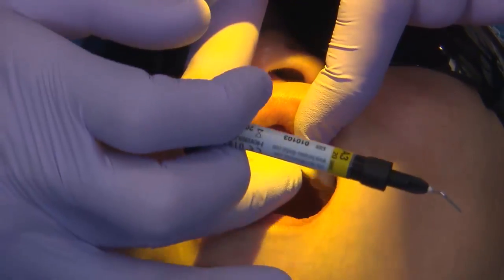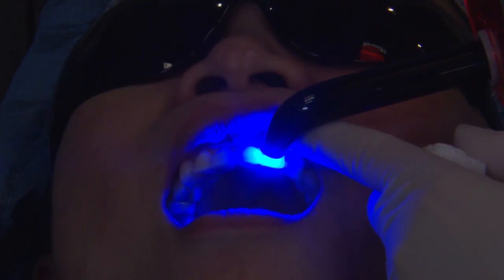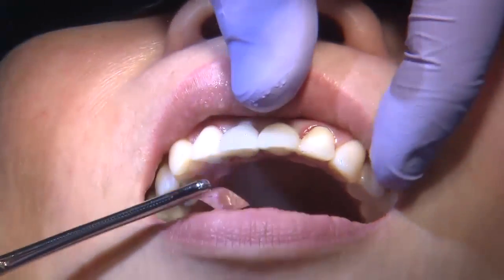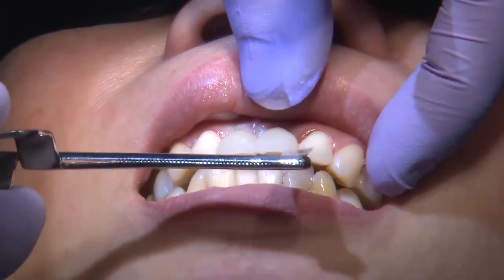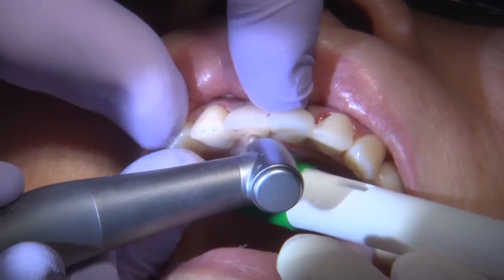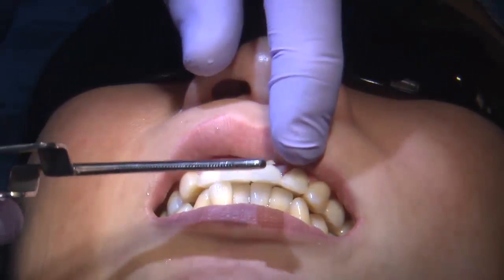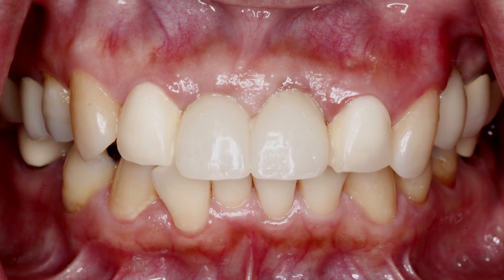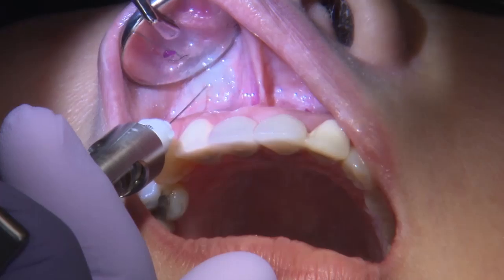Usually for a site like this in the maxillary anterior, I want those implants in place for about three to four months before I go back, remove the temporary, and start the final impression phase. I'll check the occlusion with shim stock to make sure the patient is not occluding on these restorations for both the centrals and laterals. Now we have a good view of the patient in the four-unit temporary. As the patient returns after a few months, I can remove these temporaries and evaluate the soft tissue to make sure it is where I want it to be.